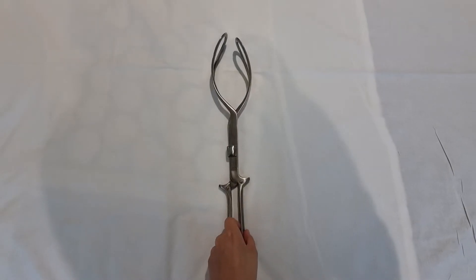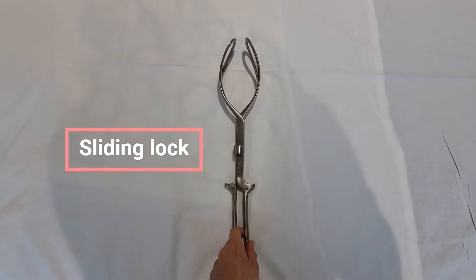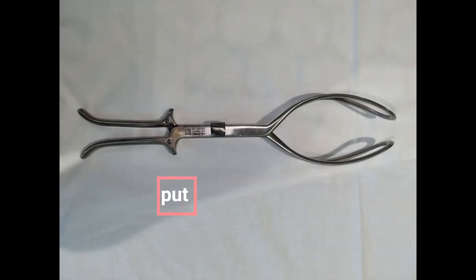The Kielland's forceps have a sliding lock. They also have the occiput dots at the junction of the shank and handle. These should be fixed in relation to the fetal occiput, which in this case, as the foetus is ROT, is on the model's right.